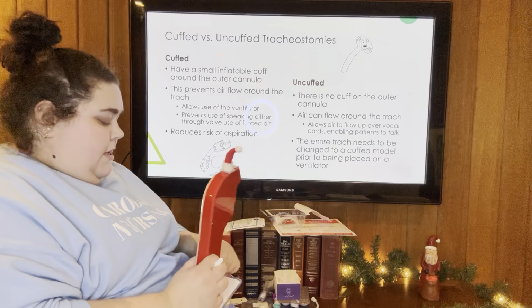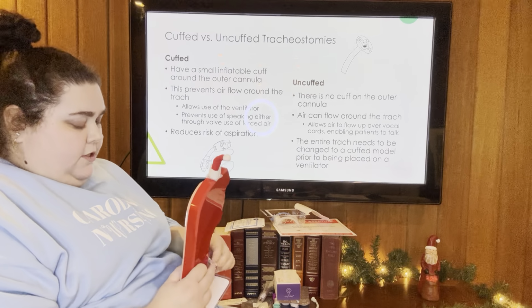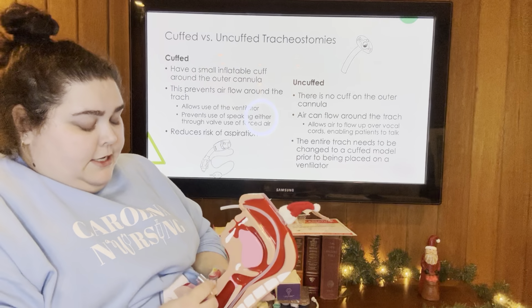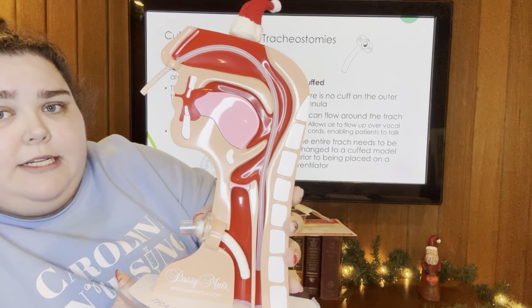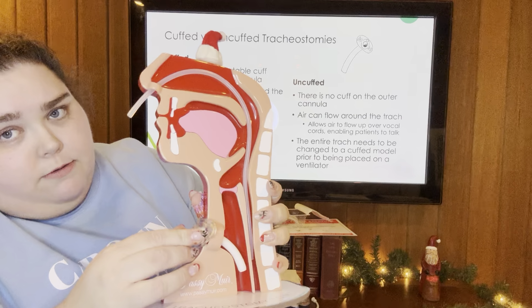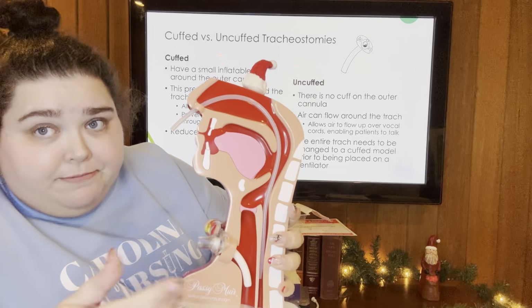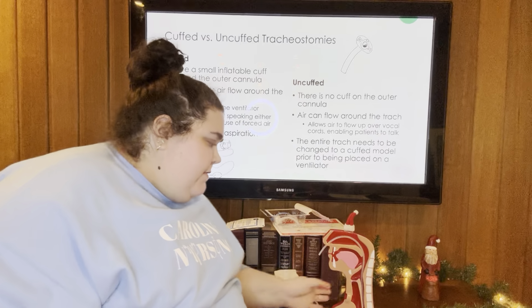We'll pull him out. Normally we would not roughhouse our patients to quite the same degree, but Tom is a pretty willing patient. So this would be how the uncuffed trach fits in the airway. You see it's got a lot more wiggle room, and obviously you'd have ties on it so it wouldn't be wiggling so much, but it has a lot more wiggle room. It's a lot less invasive in the airway than the cuffed version.